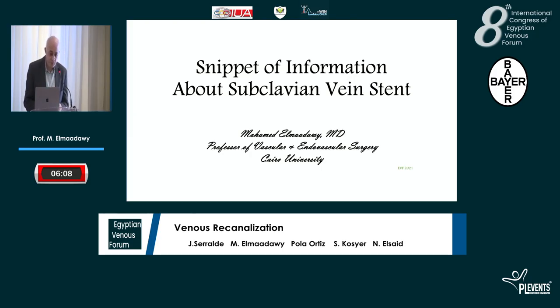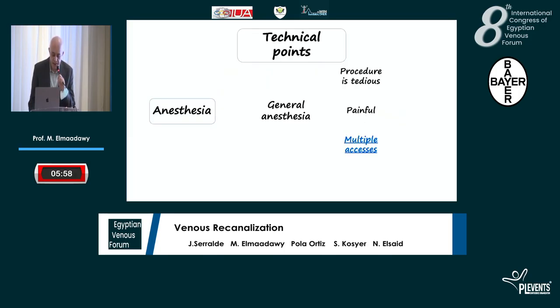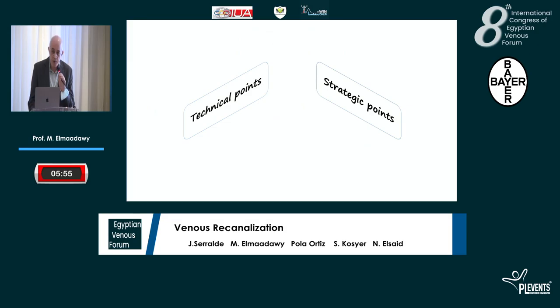Thank you. What I'm going to talk about is different. We are focused on subclavian vein stenting. I'm going to tackle it from two points of view: first the technical point of view, and second the strategic point of view.